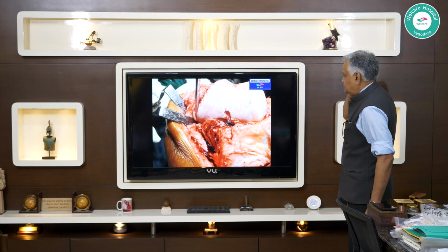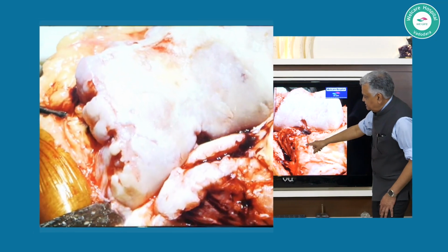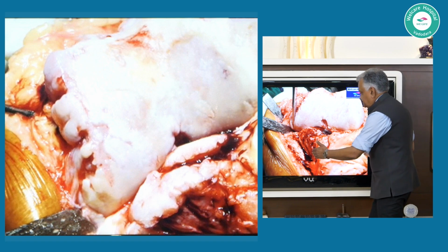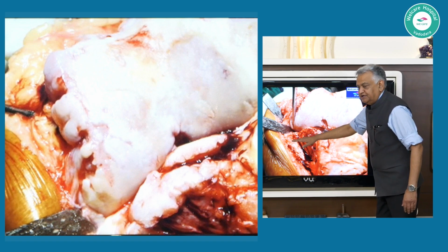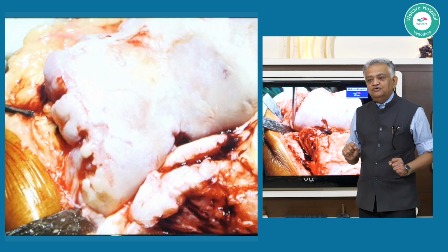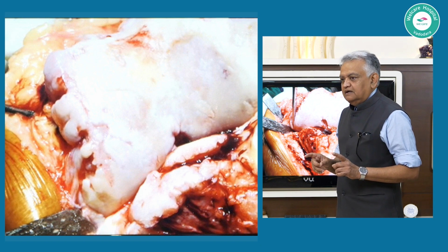Up to the tibial. So go back, see here. Now this is your femur. And now if I apply my tibial jig here, this build-up here will give me the impression that I am taking away a humongous part. So if you reduce your osteophytic build-up, so always do that.